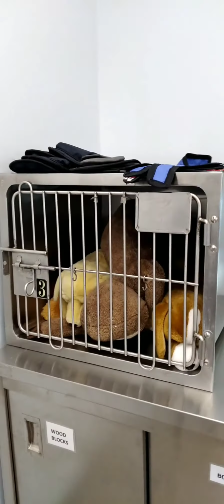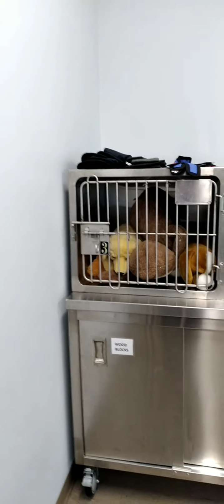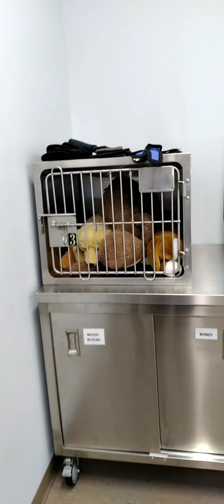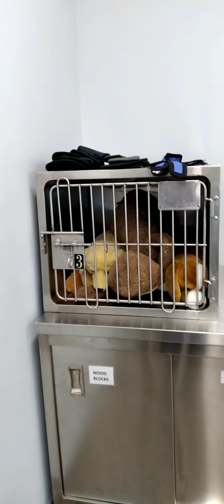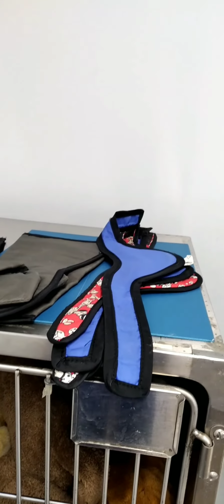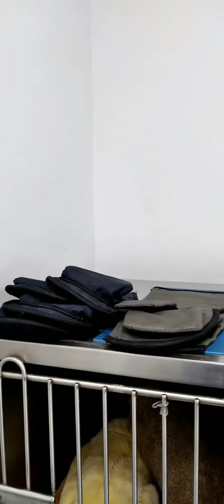We have a holding cage in case we need to just temporarily keep an animal contained while we're getting things ready for x-rays. Right now we just have a bunch of stuffies in there. We use a lot of models in this course, so this is not a bad place for them, but obviously the stuffies would have to be coming out if we had to put a cat or a small dog in it. On top of that cage though is some of our PPE that we use. We have some thyroid shields all in color, and we have various colors and sizes of radiography mitts and gloves.